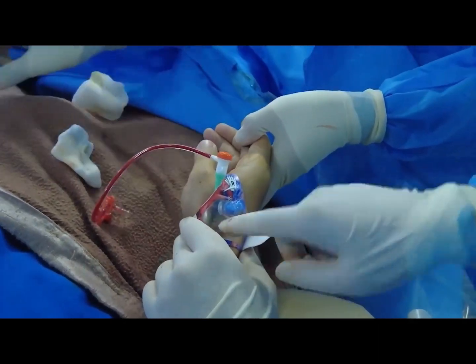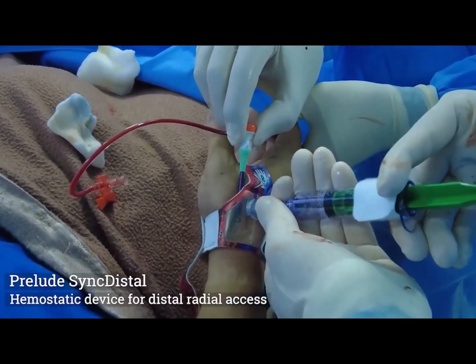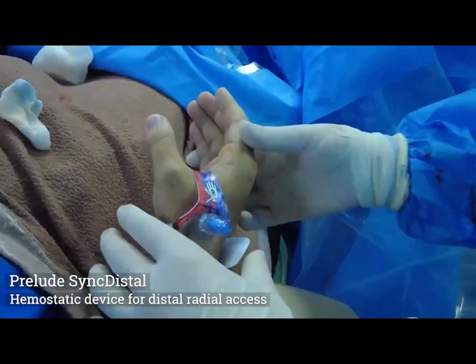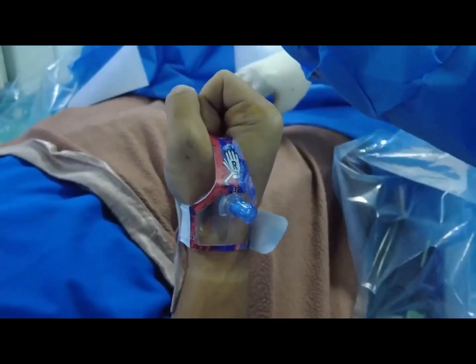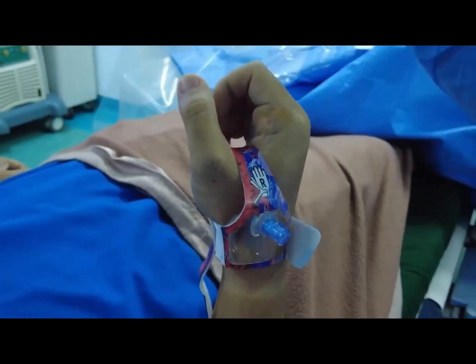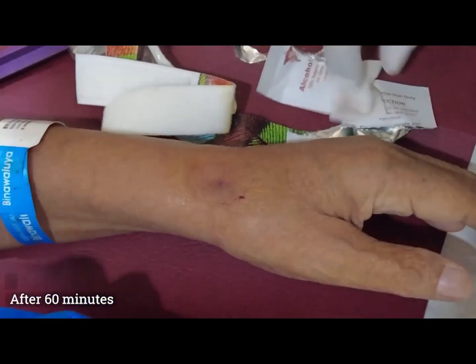So Dr. Kimeneh, who invented this design, which makes the patient very comfortable even right after the sheath was taken off. And then we asked the patient to move the finger and the hand to make sure that it's very well fixated. And then we can see after 60 minutes of observation.